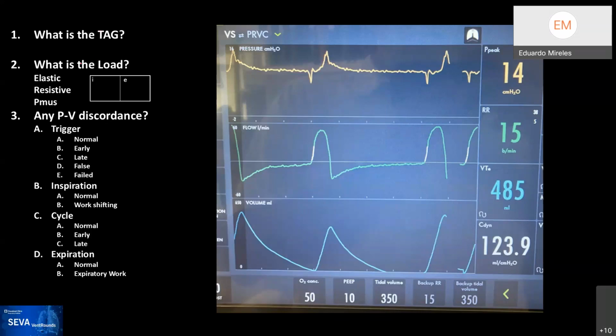Let's say this is pressure support. Sorry, pressure control. Pressure control.